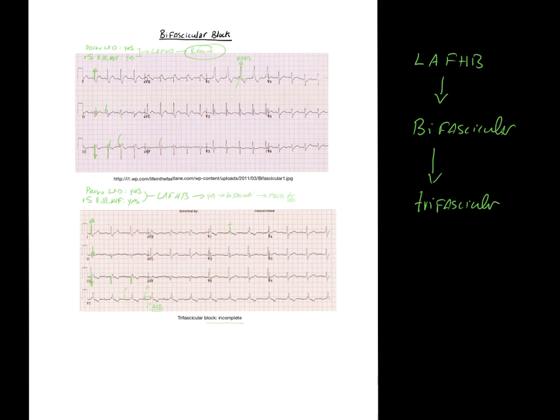It's done. But what's going on with the conductive system? You're not gonna have a sinus rhythm anymore. Okay. And so what kind of rhythm are you probably? Escape. Some sort of escape rhythm, right? It's gonna be slow, bradycardic.